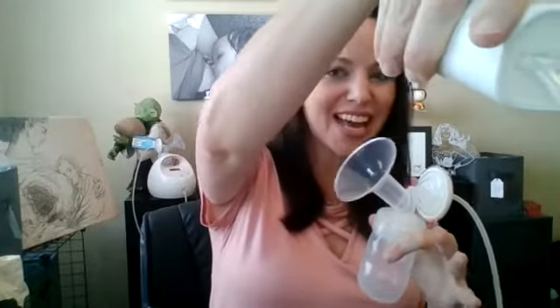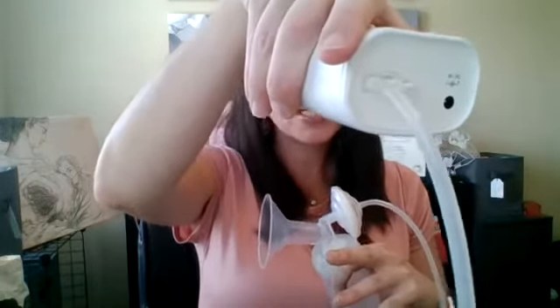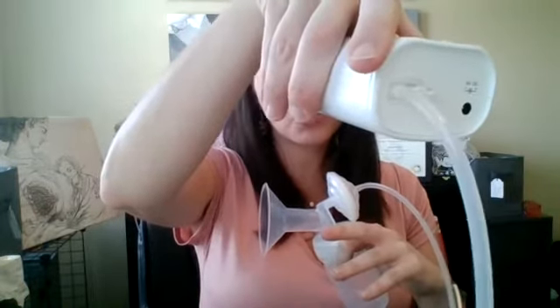Now let's look at the S9 Plus, because we've talked a lot about the S1 and S2. Just like the S1 and S2, the S9 can be used as single or double pump. There is a different voltage — the S1 and S2 use a 12-volt adapter, while the S9 uses a 9-volt. So if you have both pump models, make sure you are not using the same AC adapter — it's very important not to mix them.